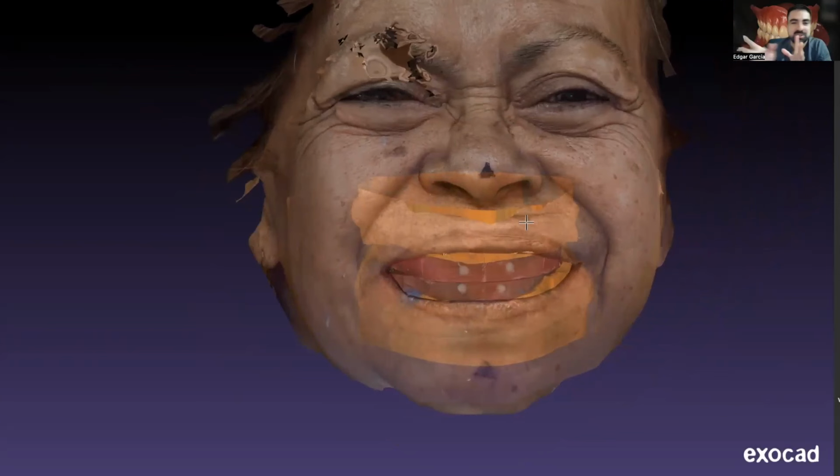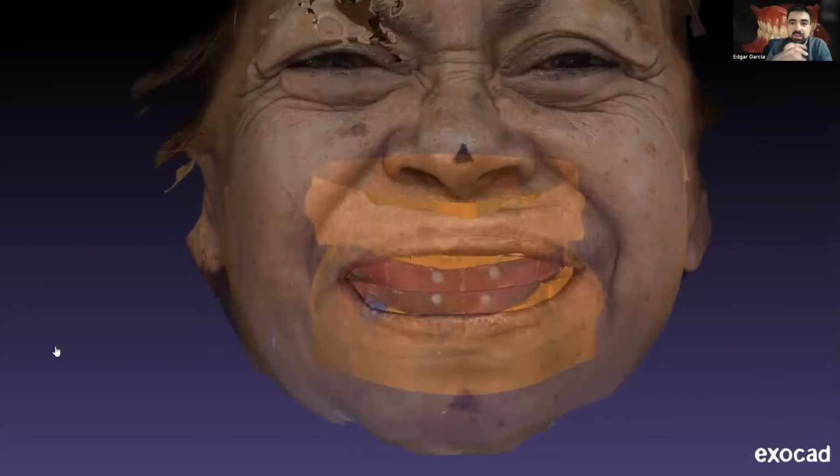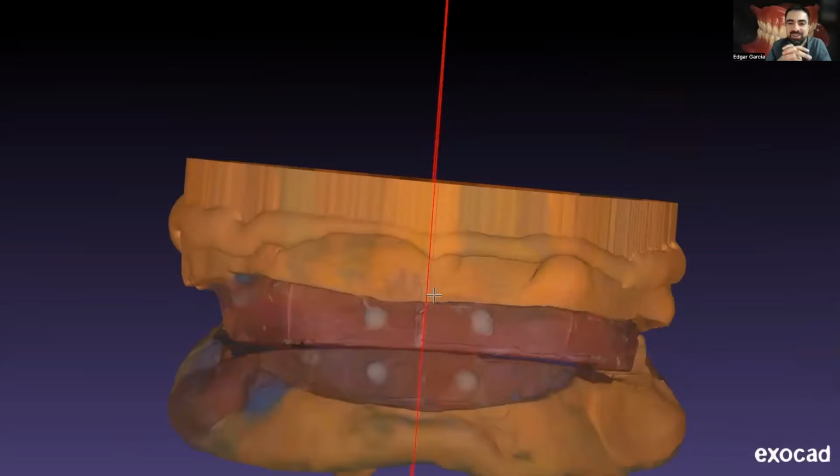The face scan that you are watching was made with an iPhone. There are several apps that you can use to do this type of face scan. The one that I use now is called Widar. It's a paid app, but it's only about $60 a year, I think. For me it works nicely. It's not super exact, but for me, it's enough. It's better than working with photos. Here is me doing it super fast. Obviously, it's sped up in the video.